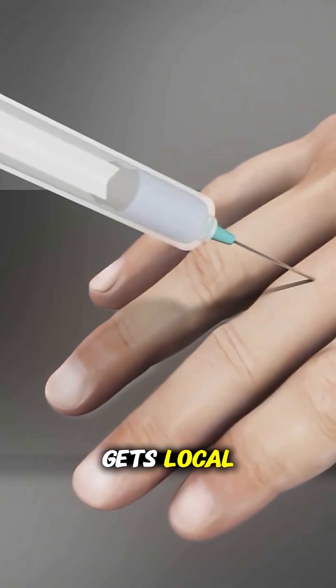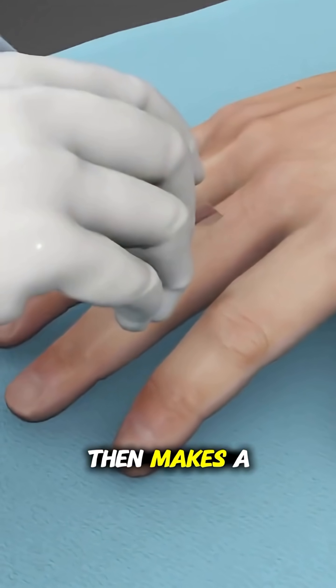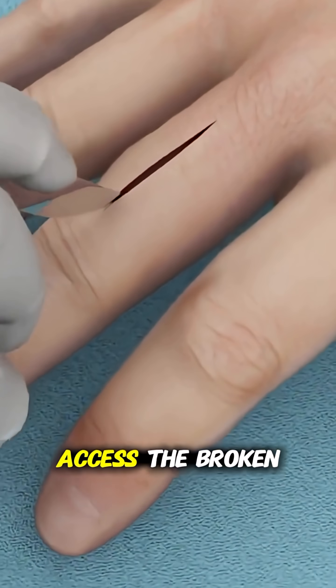First, the patient gets local or sometimes general anesthesia to numb the area. The surgeon then makes a small incision to access the broken bone.